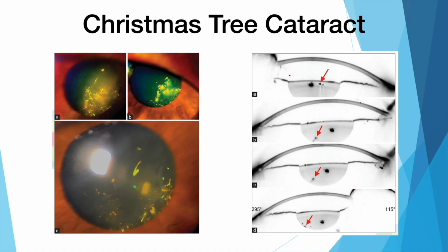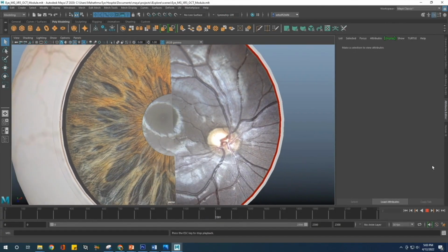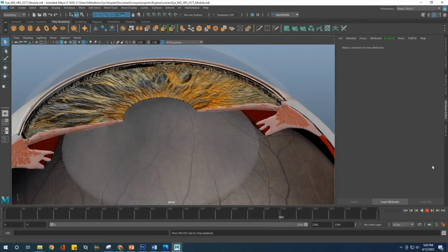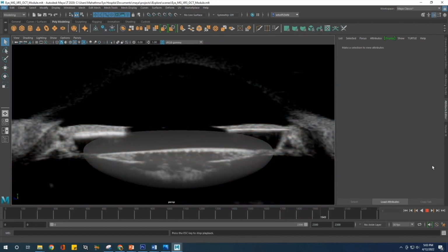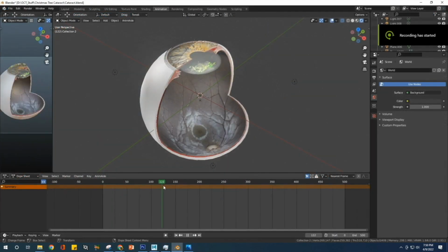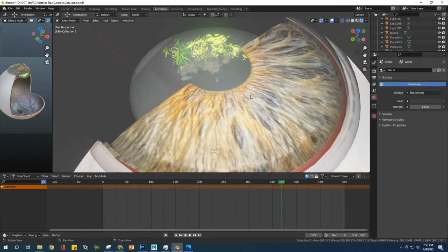In a Christmas tree cataract, 4D holographic phakic lens can be viewed to plan the intraoperative phacodynamic parameters. Doctors can also choose the ultrasound biomicroscopy template whenever needed for anterior segment pathologies. A good slit lamp photograph is mandatory for generating anterior segment holographic structures.